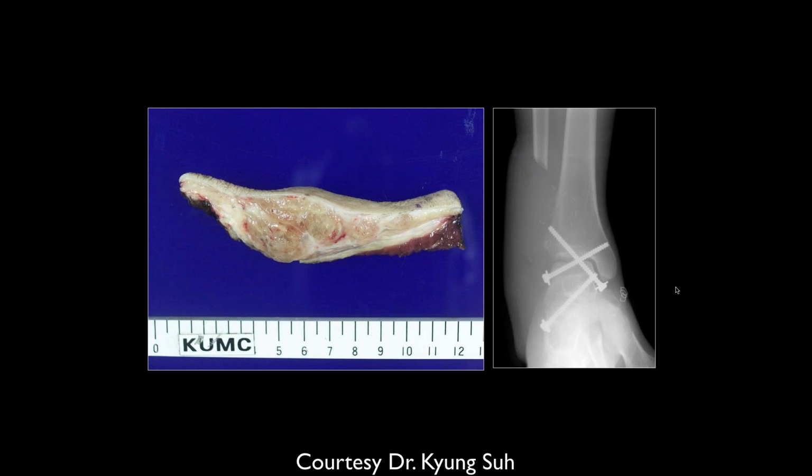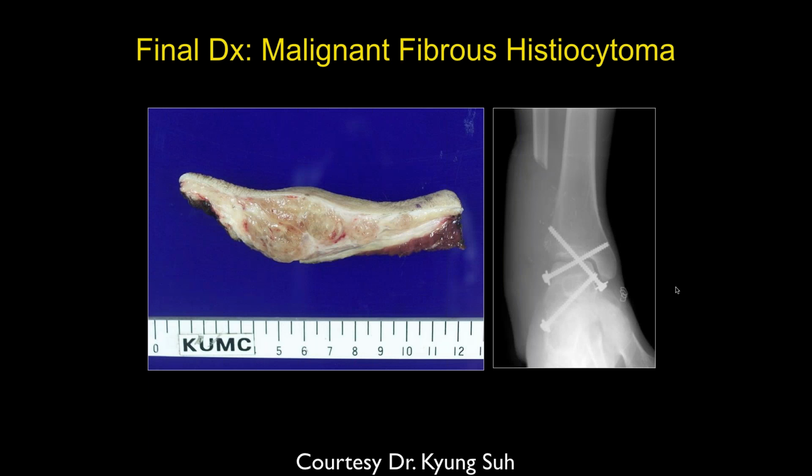Not sure. Is it fibroma again? Well, this is what they did to it. So maybe liposarcoma, or no, it wouldn't be a liposarcoma. So this is a malignant fibrous histiocytoma.